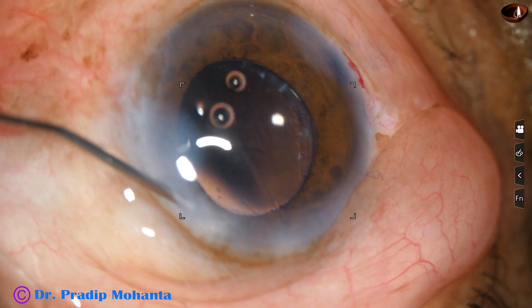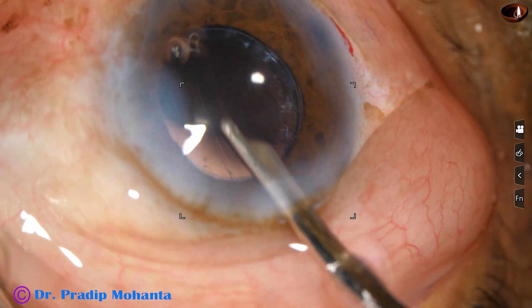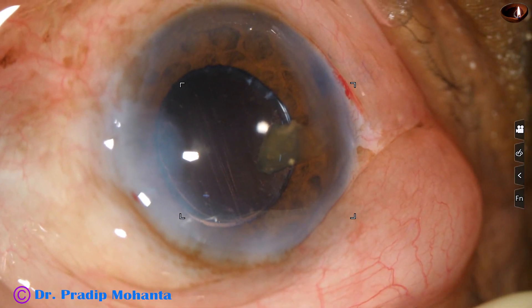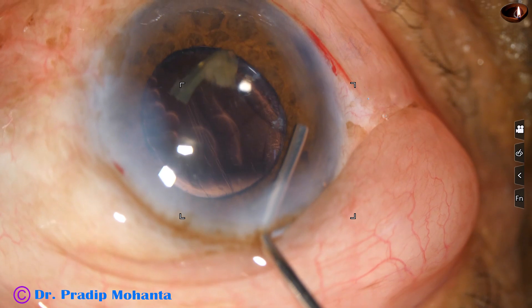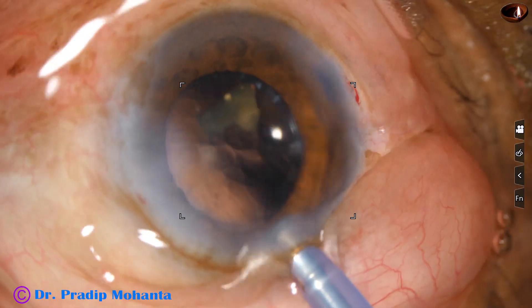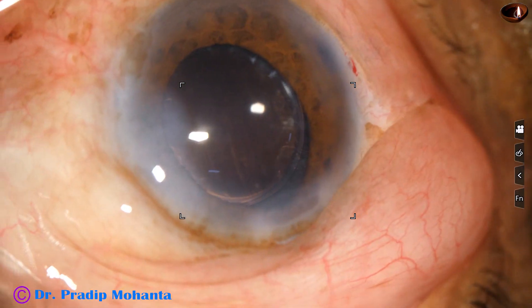I was going to finish the case by hydrating the side ports, but as I give a last lavage, suddenly this thing comes out — and this is a hard nuclear piece that will not come out through the main wound. I have to enlarge the main wound. Another way is to not enlarge the wound but instead inject visco and emulsify this nuclear piece with the phaco handpiece. So here it goes — use a little bit of ultrasonic energy and emulsify this piece. So it is done.